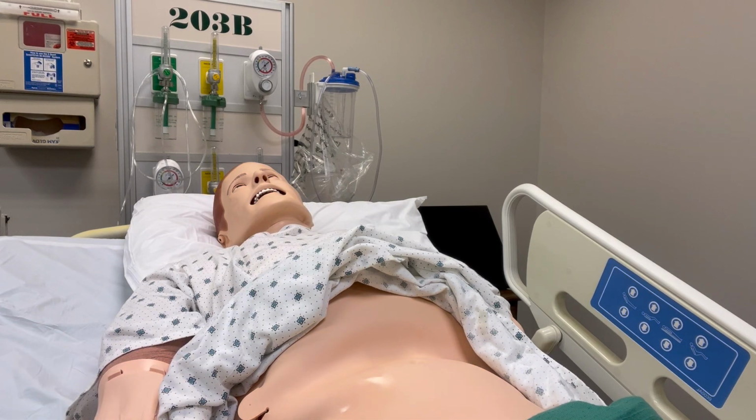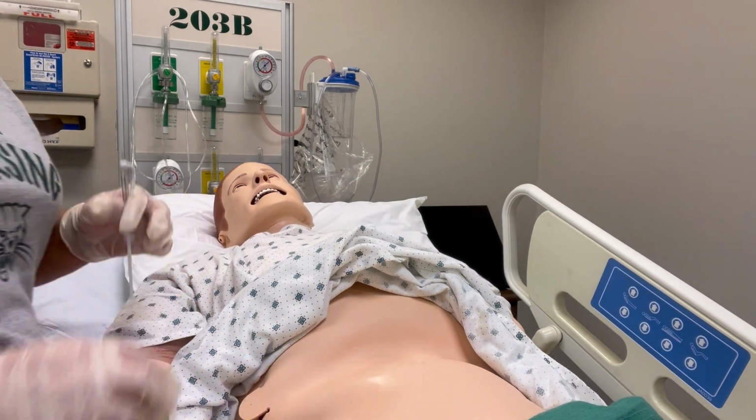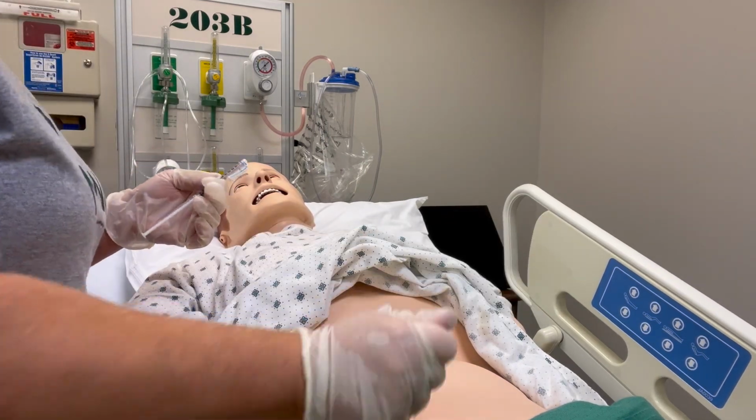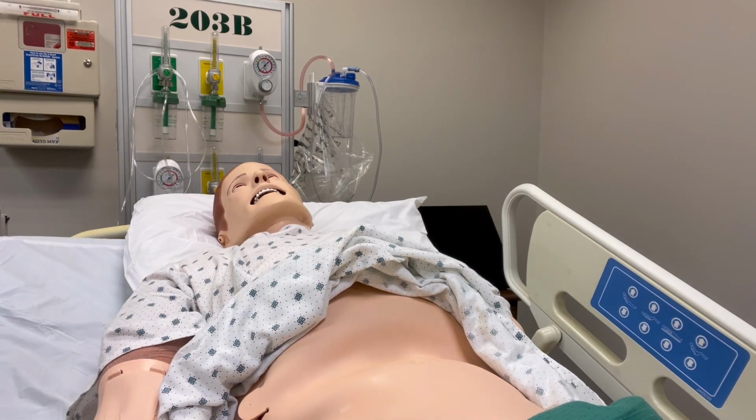And remember that when you're cleaning, if you're using alcohol, you need to clean in a circular motion. If you're using CHG or ChloraPrep, then that has to be done in a back and forth motion. Please be sure that you know the policy where you work and what is required. And again, we need to make sure that we let this dry. That drying is really the part that kills all those germs and bacteria.